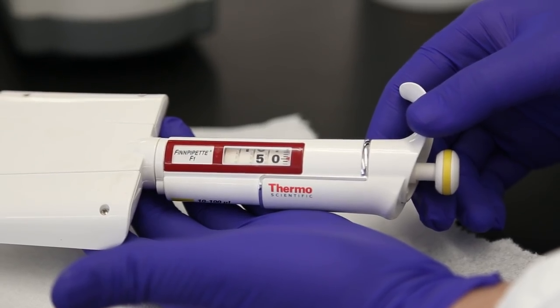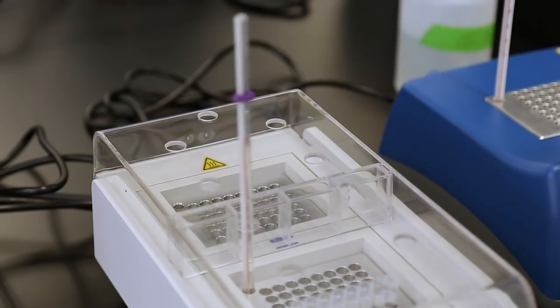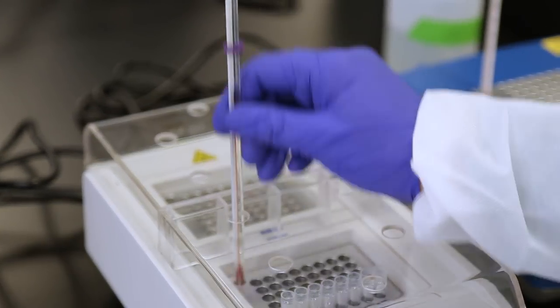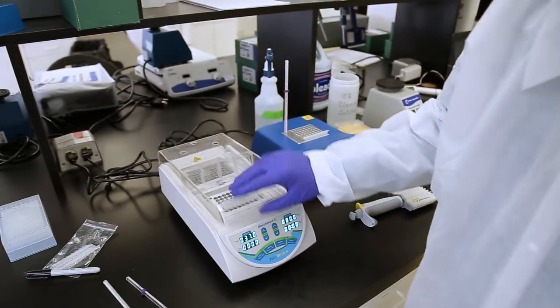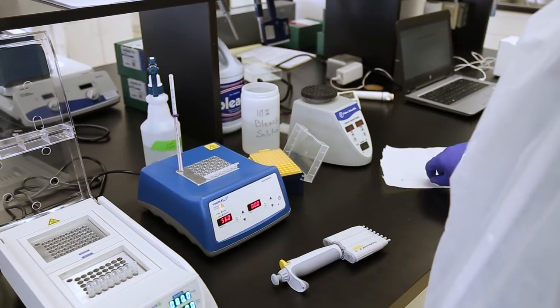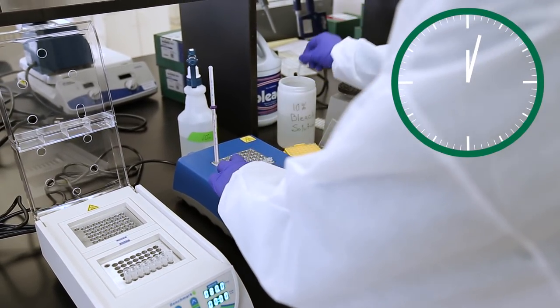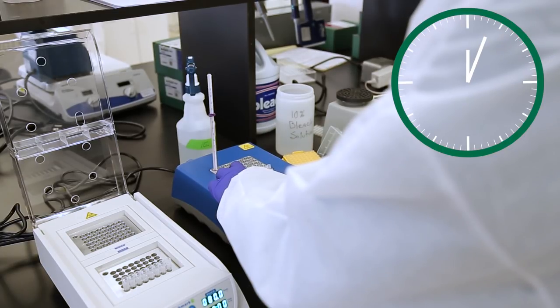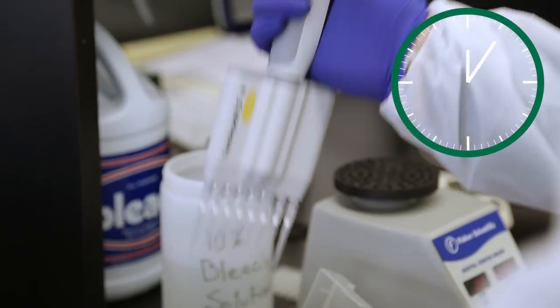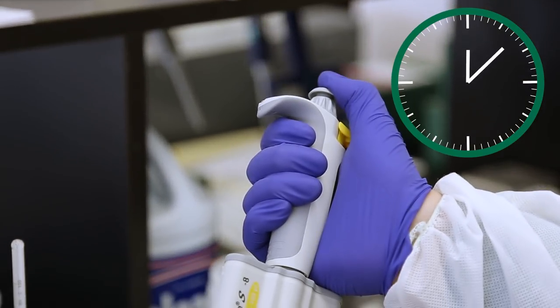With the 8 channel pipetter set to 50 microliters, remove the thermometers from the dual heat block and open the lid. With the reaction tubes still on the 56 degrees Celsius heater block, remove the caps from the reaction tubes. Place the used caps into the 10 percent bleach solution.